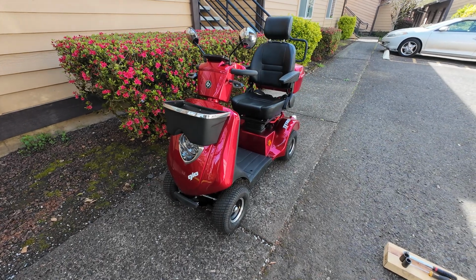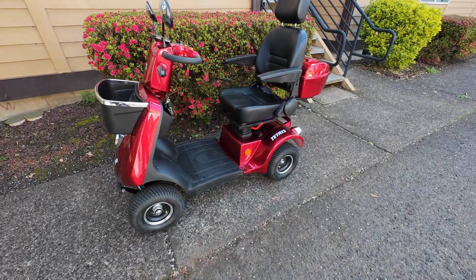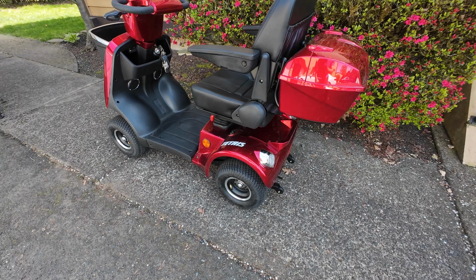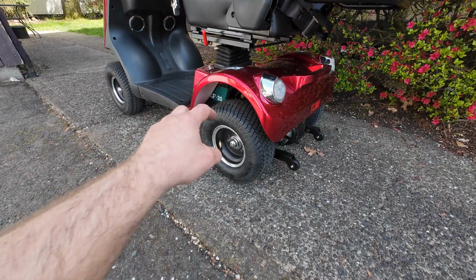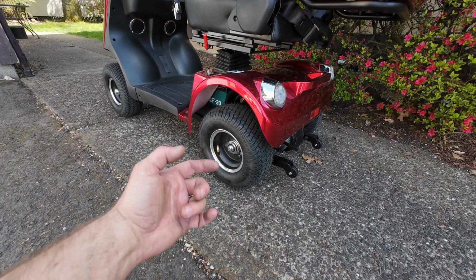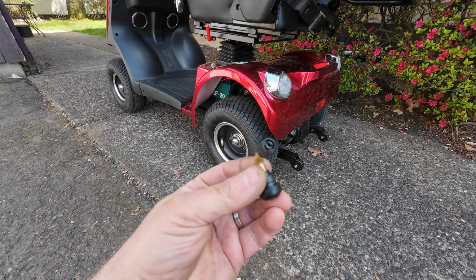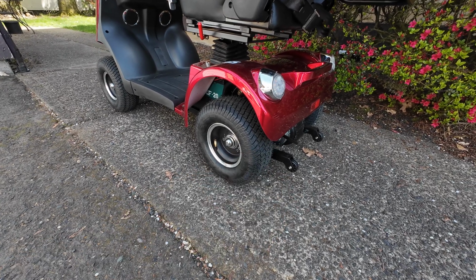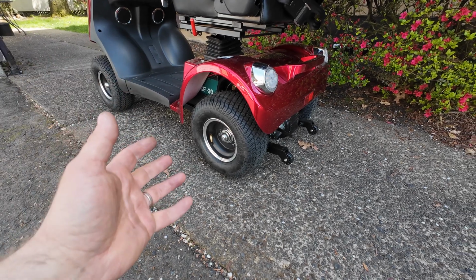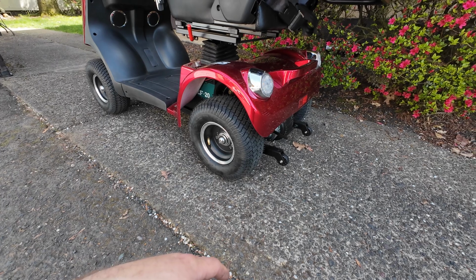Hi guys, so if you have a Gio Tetris mobility scooter and you ever need to remove your wheel because you're trying to do some repairs, maybe it's not possible to do repairs from the outside and it has to be patched from the inside, or maybe you are replacing the inflating valve, or replacing a complete wheel that you purchased because you damaged your rim. So you need to know how to do the proper replacement.